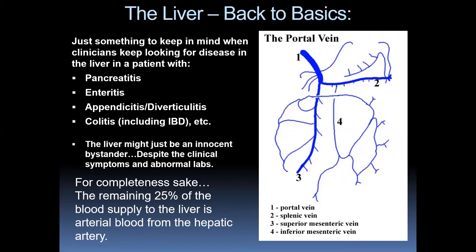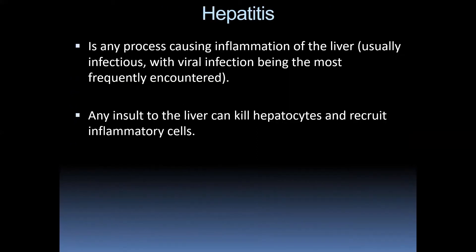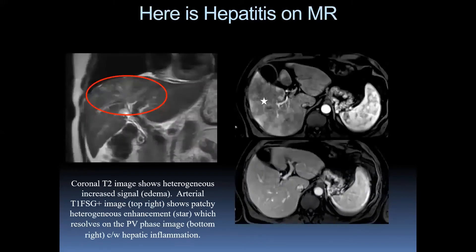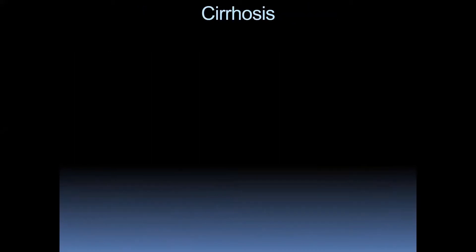For completeness, the remaining 25% of blood supply to the liver is arterial blood from the hepatic artery. Hepatitis is any process causing inflammation of the liver, usually infectious — viral infection being most frequently encountered. Any insult to the liver can kill hepatocytes and recruit inflammatory cells. Here is hepatitis on MR: coronal T2 imaging shows heterogeneous increased signal — that's edema — and the arterial post-contrast image shows patchy heterogeneous enhancement which resolves on the portal venous phase, consistent with hepatic inflammation.